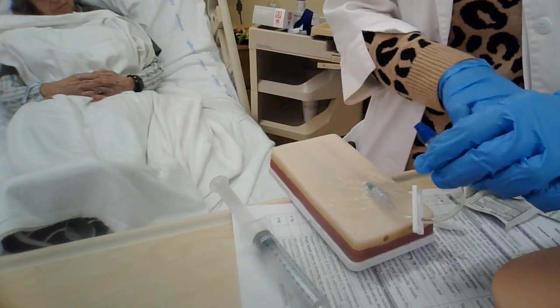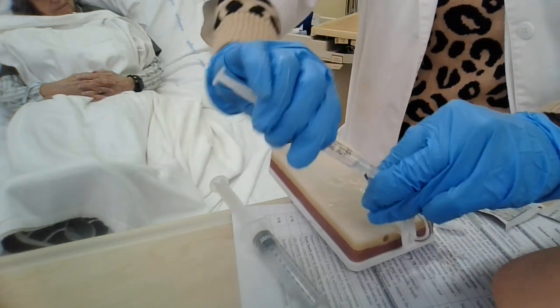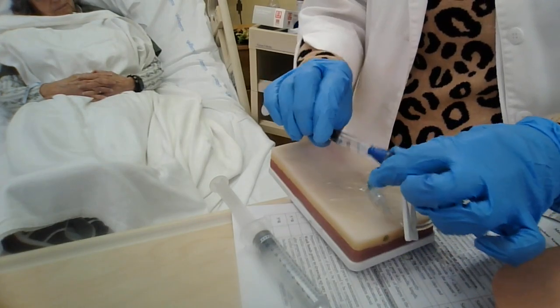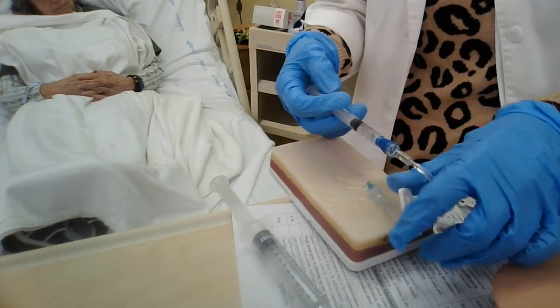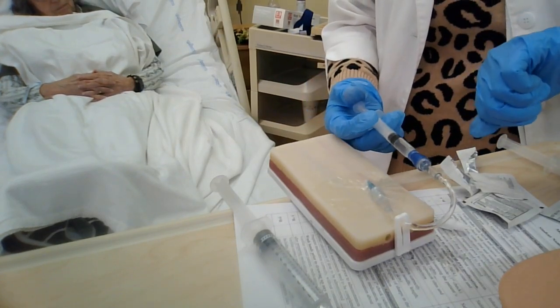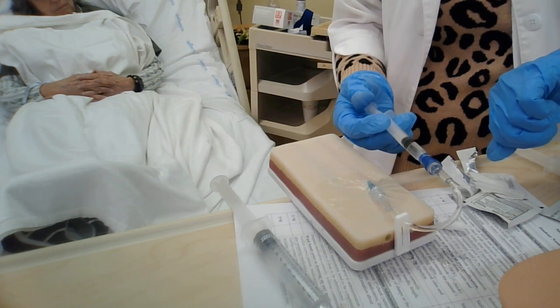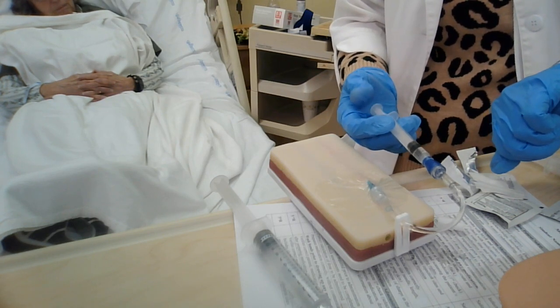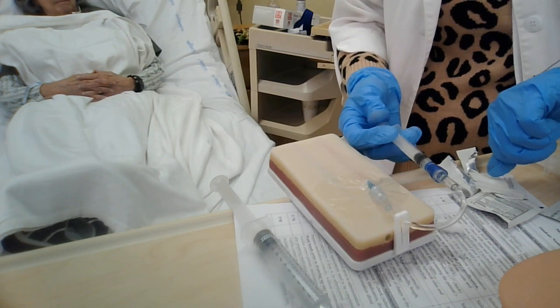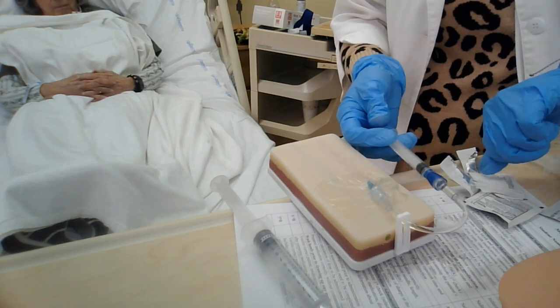Okay? And now I've got my Lasix. So I've got 2 milliliters, and I know I have to give that over at least 1 minute. So this is where you would take out your watch, and you're going to do a slow push, stop over 1 minute. Okay? For the purposes of time, we're going to say a minute has gone by. I'm kind of slowly pushing and stopping. We'll give it over a full minute. And there's some medications that you might be standing here for 5 minutes, like for morphine or Dilaudid, where you have to give it slowly.